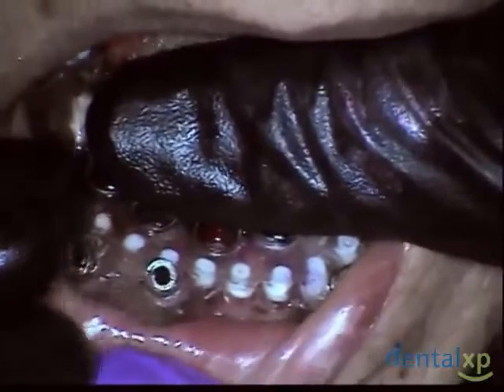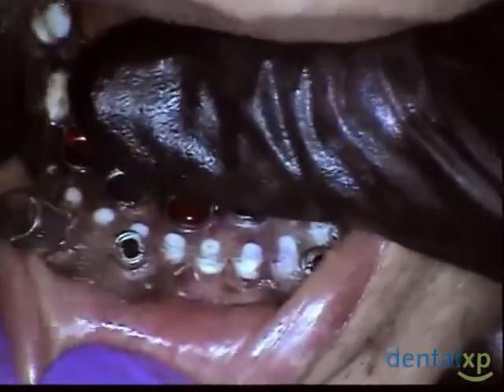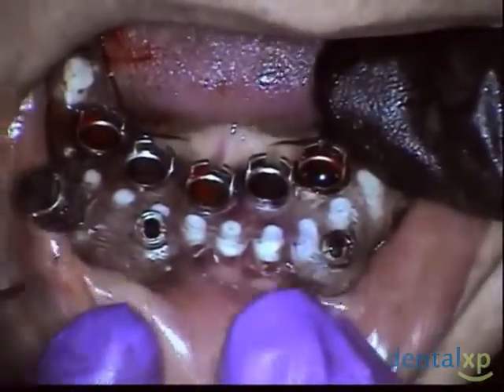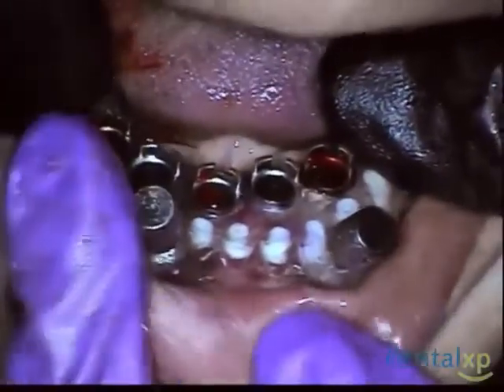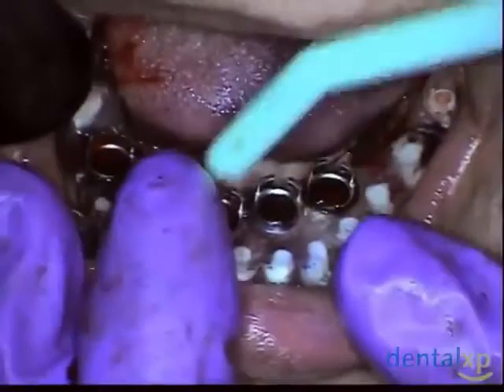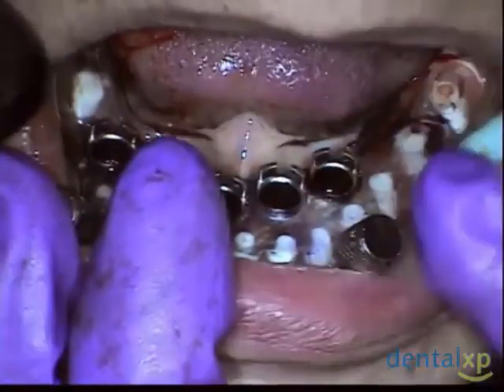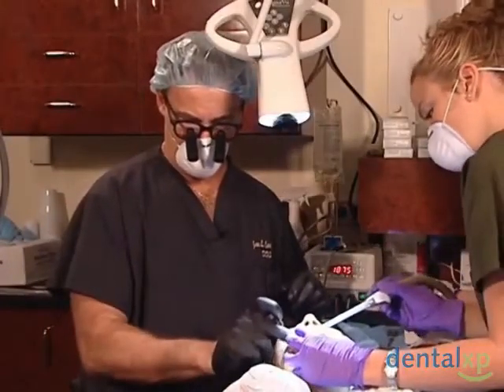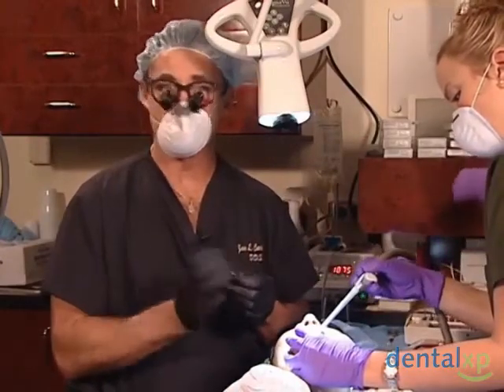Now, what you can do here, if we've determined that we have adequate amount of attached tissue, which we did with our blue markers, the marker was inside of the confines of the buccal and lingual attachment, so this makes life a little easier for us. We can go now with our countersink, which will fit right in the surgical guide, and it again is stabilized, so I'm not worried about it going back and forth.